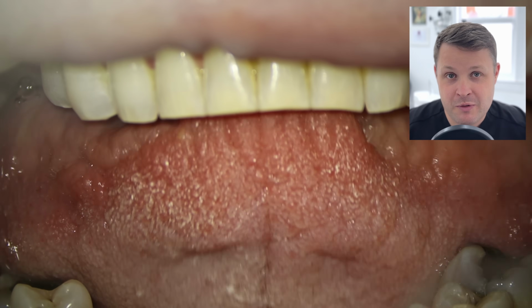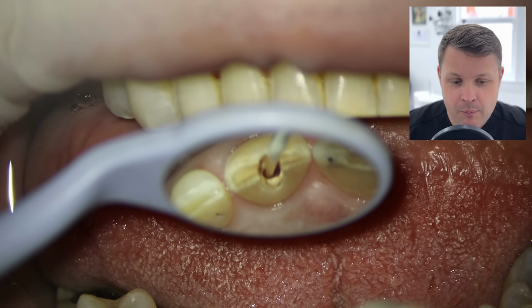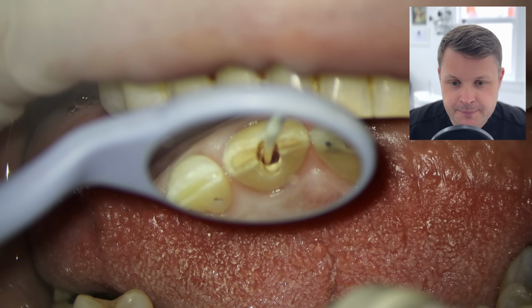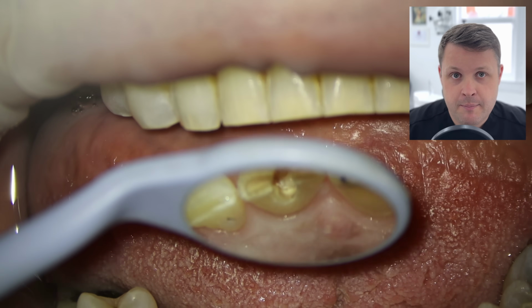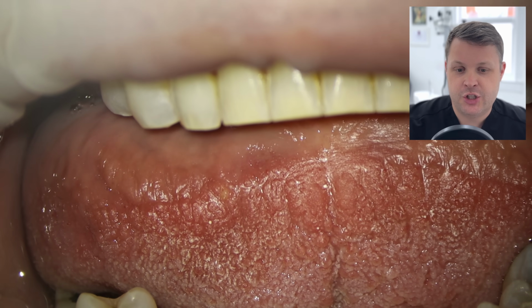And I said to him, well, we've run out of time. We're going to dress the tooth, and we're going to get you back in. So I'm going to dress the tooth with non-setting calcium hydroxide, PTFE tape, and GIC.